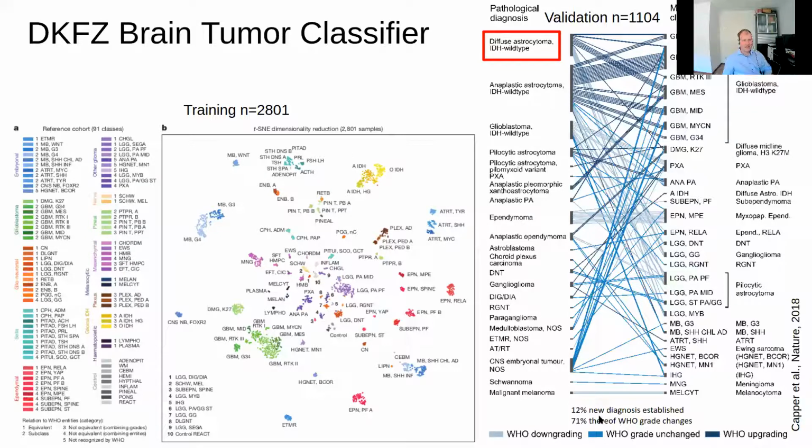And the horrible thing for us neuropathologists, because we had a pretty high confidence in ourselves, was that there were many, many diagnoses wrong, like 12% of misdiagnoses across expert centers in neuropathology, and almost three quarters of them were WHO grade changes. And this means a different treatment in clinical terms. So every 10th patient approximately would go out with a wrong diagnosis. And all that led to the acceptance of this methylation-based classification of brain tumors.